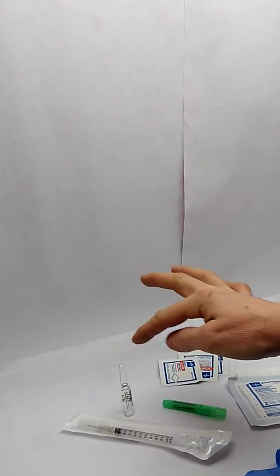I'm a student nurse. This is my return demonstration for a heparin injection. Initially I will grab the materials I need, which are one pair of clean gloves, at least 3 packets of alcohol pads, one 2x2 sterile gauze, a 1 cc TB syringe with a 27 gauge needle attached, the practice glass ampule, and a filter needle.